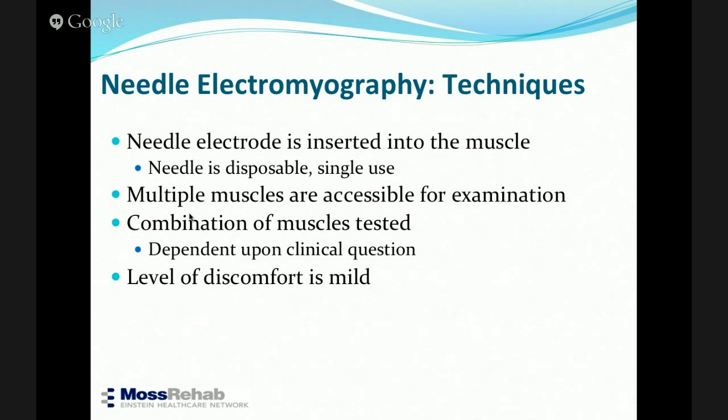Now, one of the things people always tell the residents when they explain the study to the patient: we're going to shock you, we're going to stick you, we're using a needle. So what you're doing is you're already creating psychological terror. So you have to be very careful of your language. You have to use softer language. I'm going to do electrical stimulation, but I'm not going to shock you. Electrical stimulation seems softer, okay? And I explain what the electrical stimulation is going to be. You walk on the carpet, touch the doorknob, you feel this electrical stimulation. That's how it's going to feel. A lot of people have felt it. So it doesn't create terror.